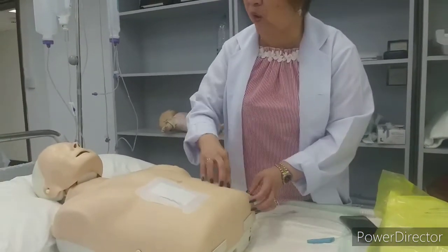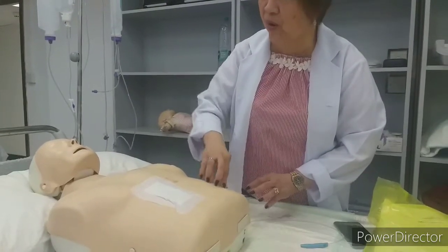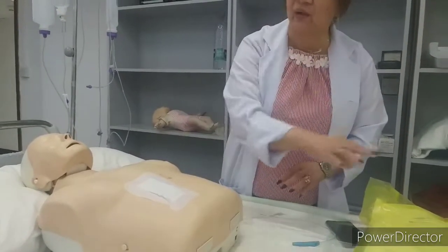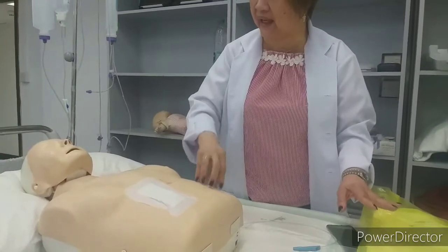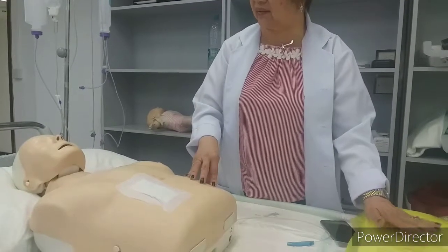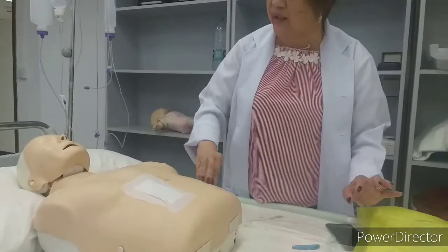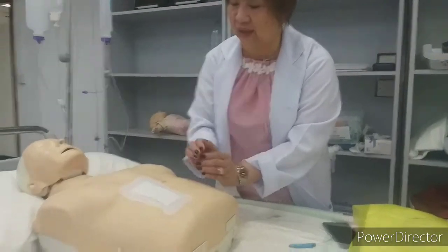So, if there is poo-poo, you will change. First is poo-poo. Clean the poo-poo. Clean out. Again, clean out. Not with betadine. Just clean with a dry or a wet gauze. Moist. So, clean, clean, clean. And then saline. Better saline. Clean already. No betadine. Only clean.